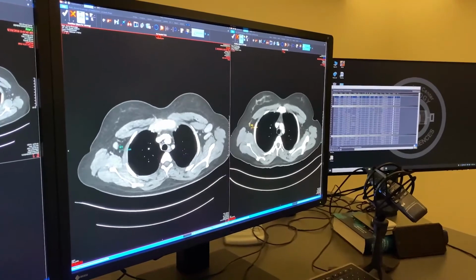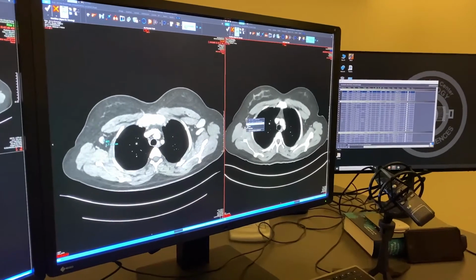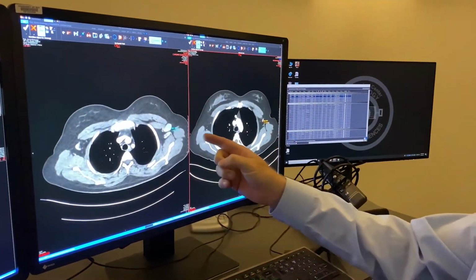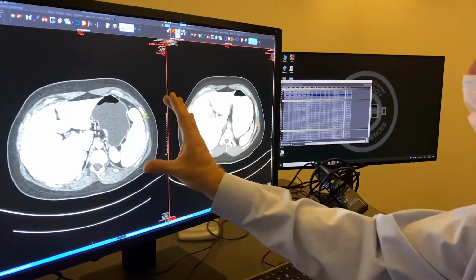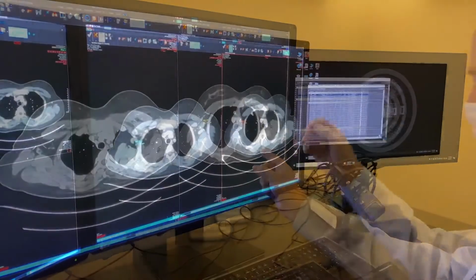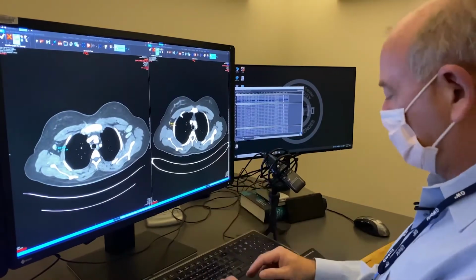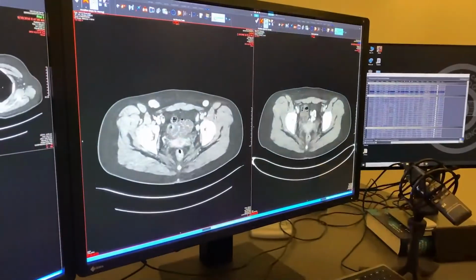And what the radiology preprocessors are doing is doing this in the background, where the machine didn't quite catch this because it's so small, it doesn't believe it's the same one. So we're thinking like the computer. So now we've got it where we can see this adenopathy is much smaller, and then these two can then make up a graph. The spleen was big before, and now is small, and this lesion is smaller here in the spleen. So I'm hitting a shortcut to say jump to this lesion, and now I'm doing a visual quick comparison of that adenopathy. So then I can go down here and look at this adenopathy there.